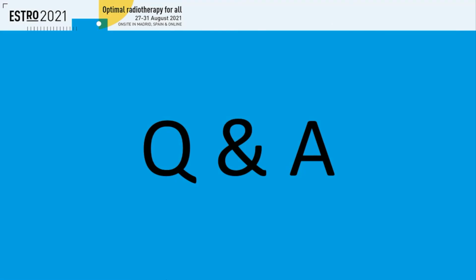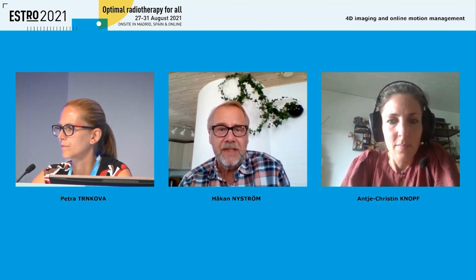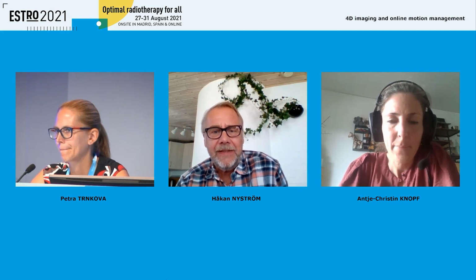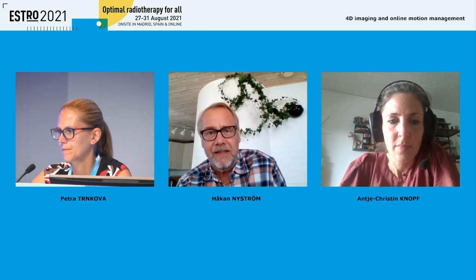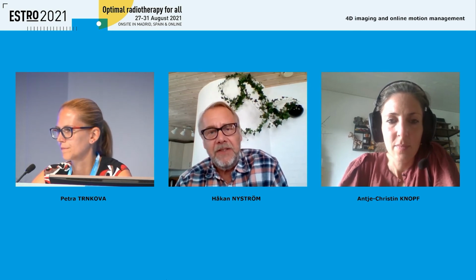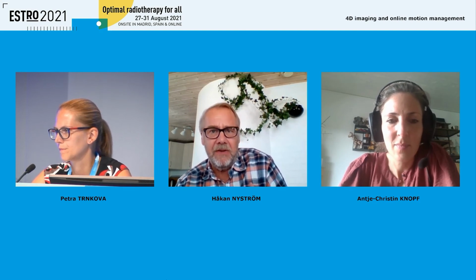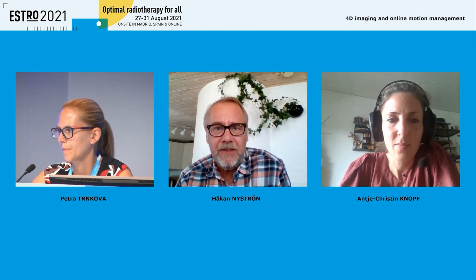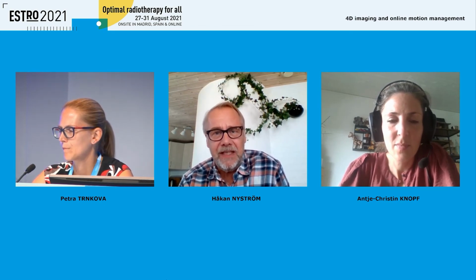Thank you very much for this very interesting and important work you presented to us. I was wondering, you mentioned that inhomogeneous breathing might be a challenge. You have a change in frequency and amplitude, and you mentioned a few ways to overcome that. But you didn't mention the possibility of coaching the patient, either visually or with sound. Can you comment on that? I thought that would be a good way to minimize changes.